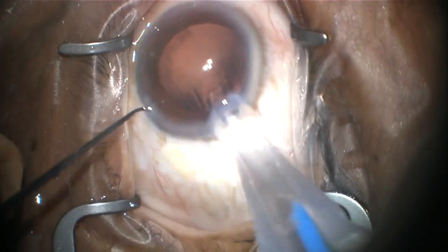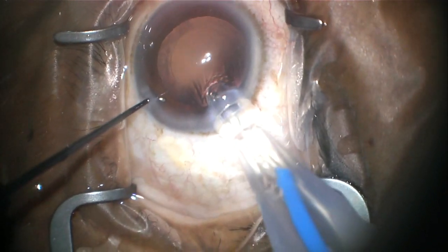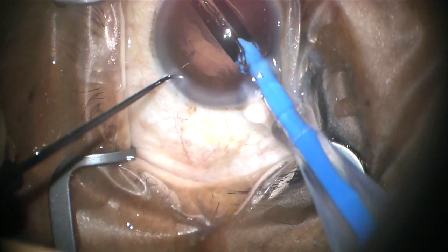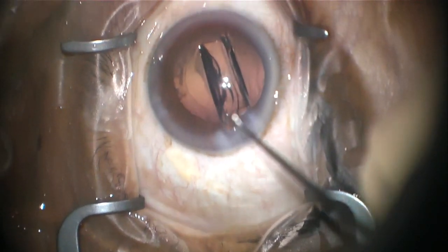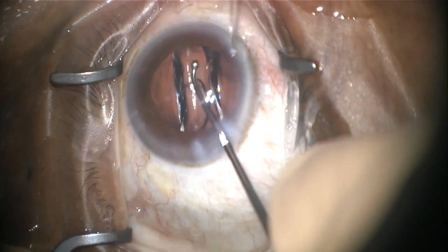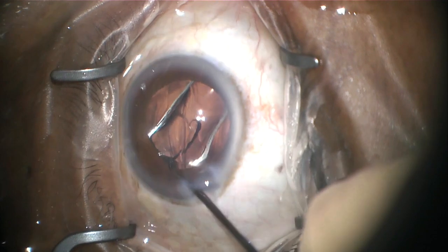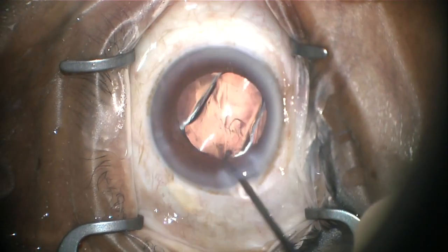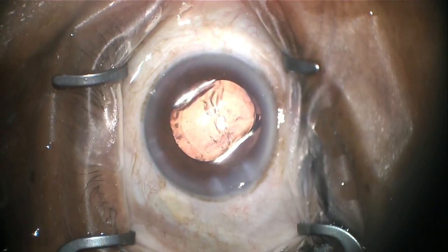The new lens, which is made out of an acrylic material, is then injected through that primary wound. After the lens has been injected, it's gently rotated and centered inside that capsular bag. The arms or haptics on that lens will help keep it centered in your capsular bag for the rest of your life.